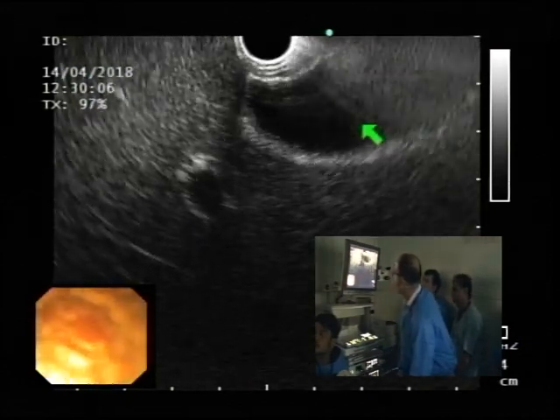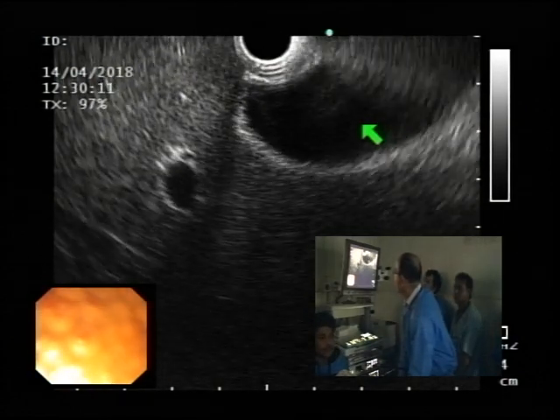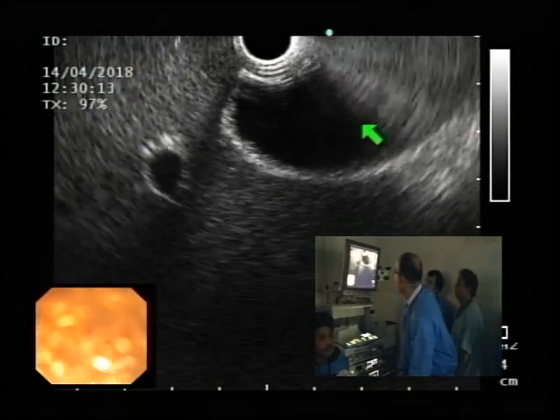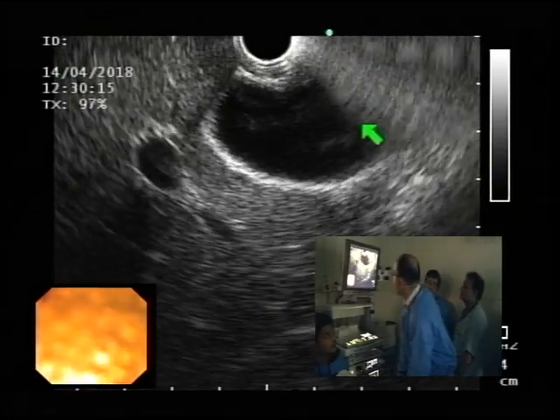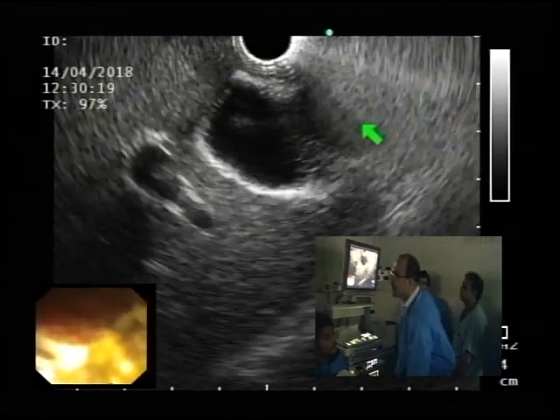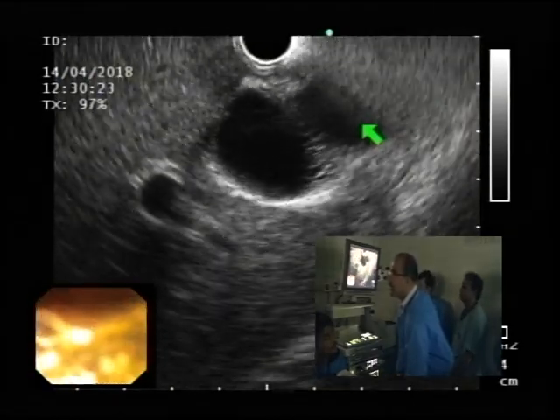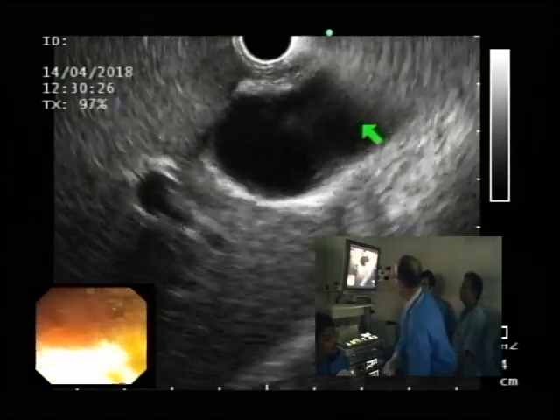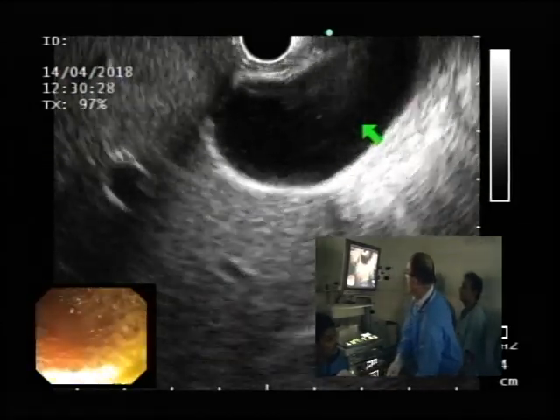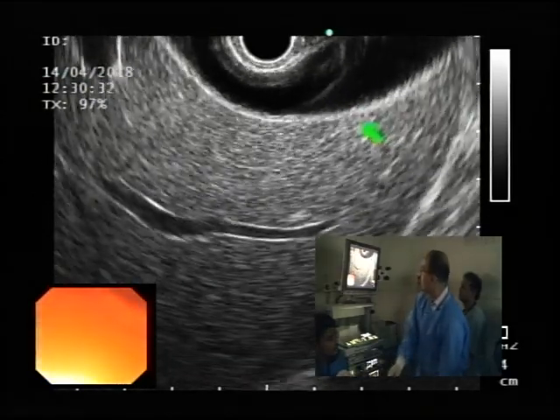If you look at my hands, they're pointing towards my feet, so they're way down. So this is the right segment 5 of the right lobe of the liver. Exactly. So I'm all the way counterclockwise inside the bulb, and also looking at the gallbladder. Go on, carry on, Khalid. Yeah. So this is the only portion of the right lobe of the liver we can see with the EUS.